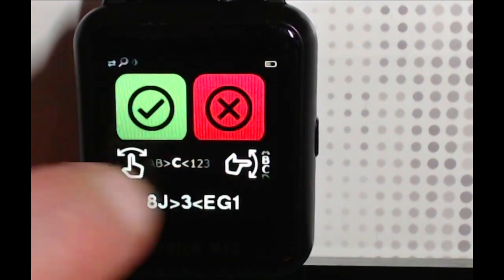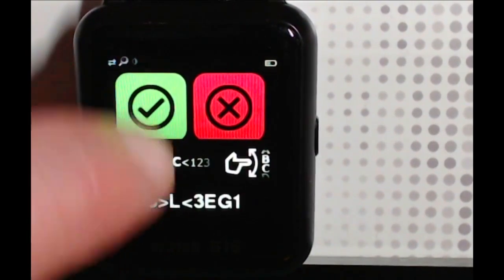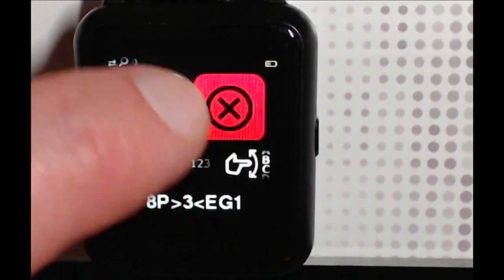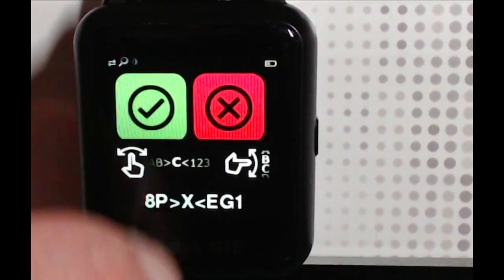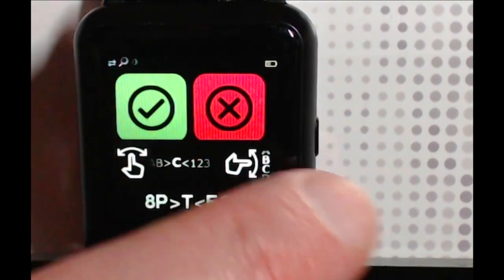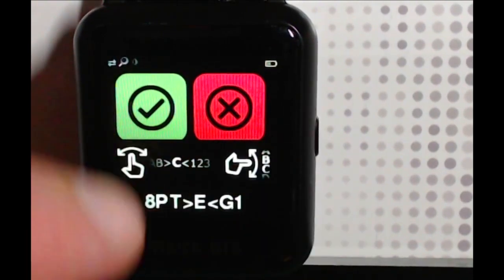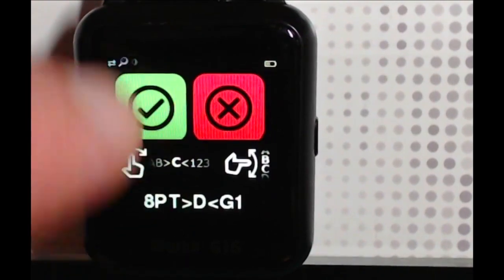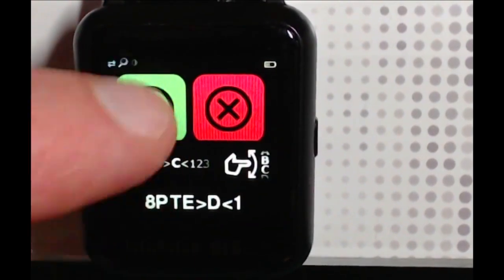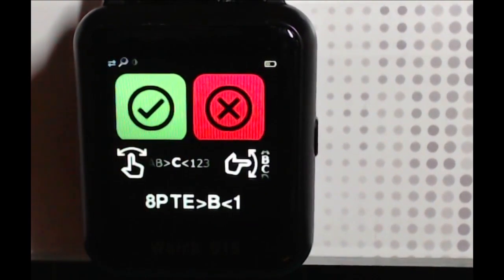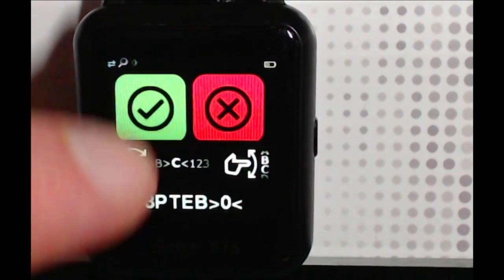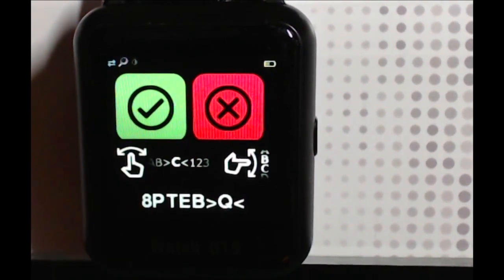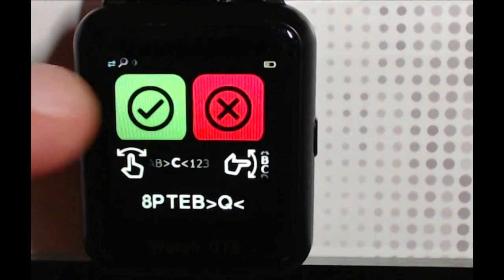This screen is different to others on the device. In order to set the transmitter ID, you swipe left and right to select which digit of the transmitter ID you want to change, and you swipe up and down to advance or go back through the letters and numbers that make up the transmitter ID. If you're happy with the transmitter ID that you've entered, you can long press on the green tick.